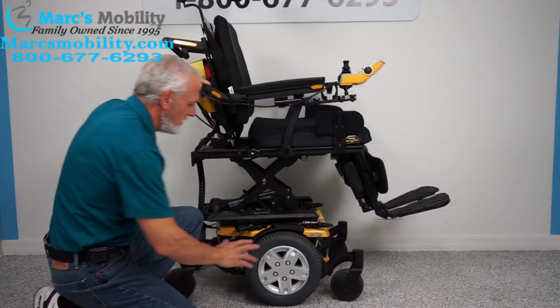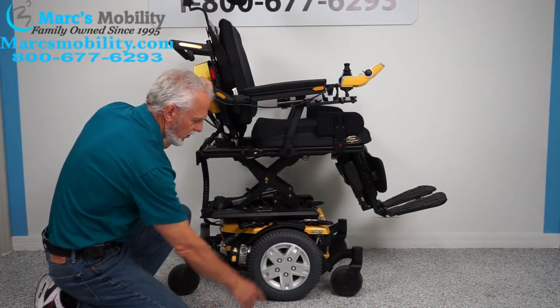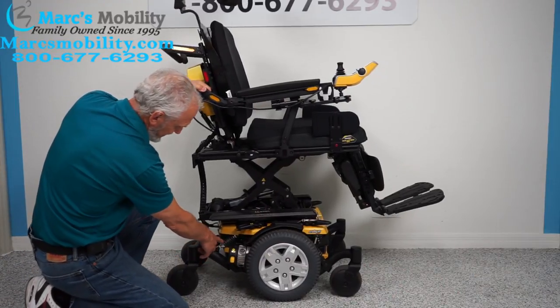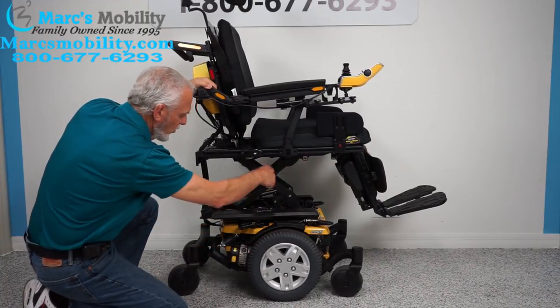Let's look at the base. You can see we have 14 inch wheels — they will not mark your floor. Castor wheels in the front, castor wheels in the back. You can see the rear suspension here. If I push the chair back you can see the suspension at work. There's four of these — one in each corner.